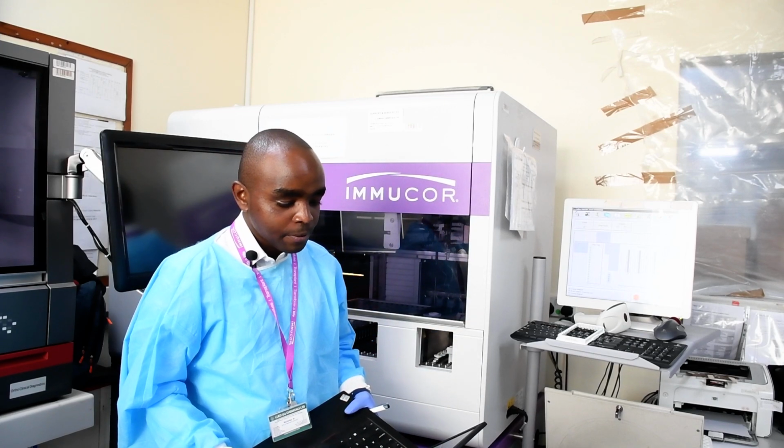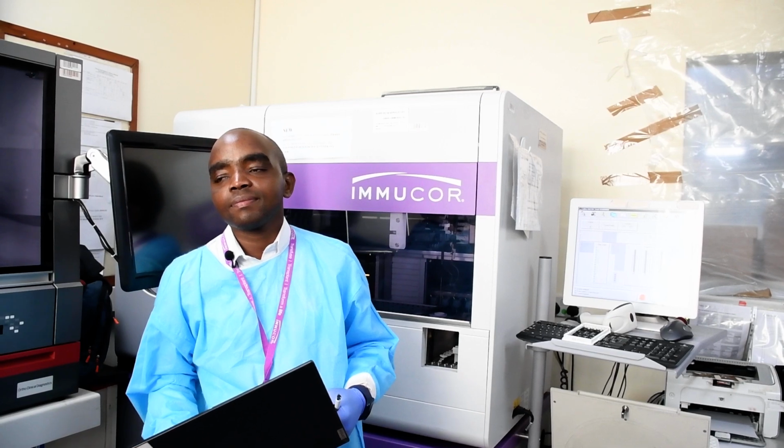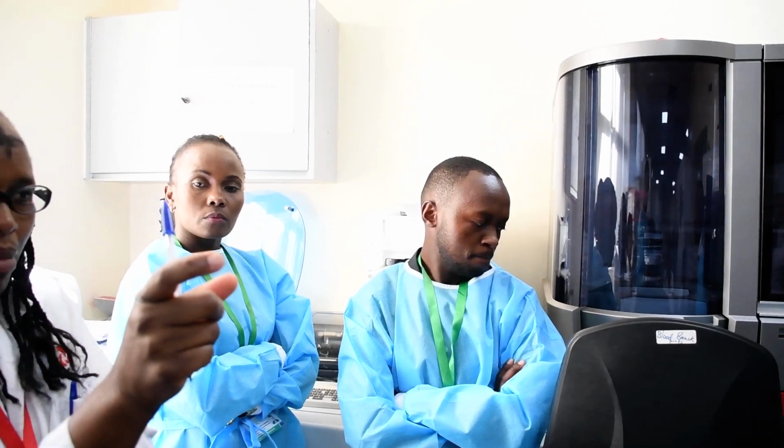So now, back to what you said, that it's selective. Yes, it's going to give you IgG, IgM. So are you going to run them concurrently, or singly? Is there a format where IgM and IgG are all set?